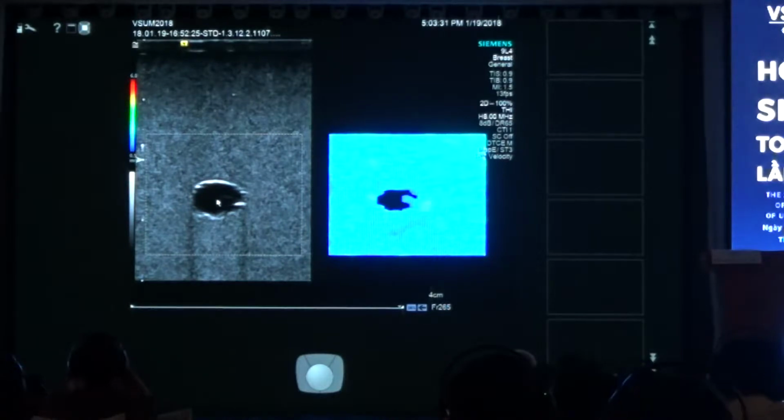If you have a complicated cyst that has some material in it, it will show up as a soft lesion. So you cannot distinguish with 2D shear wave if a lesion is a fibroadenoma or a complicated cyst. On strain imaging, this lesion will give us a bullseye, so we will be able to say it's definitely a cyst and not a fibroadenoma.